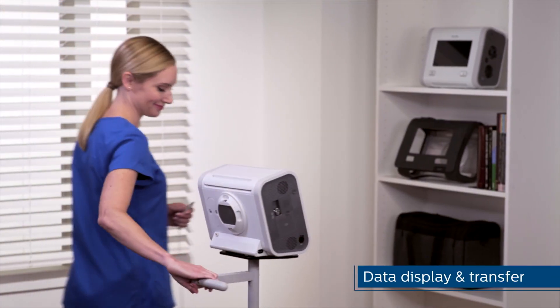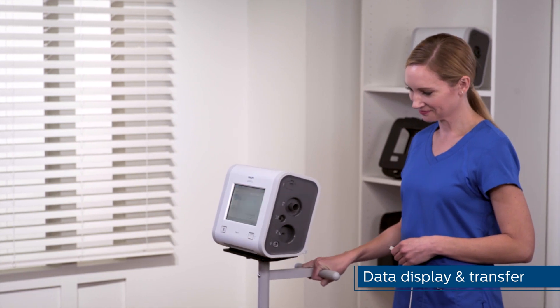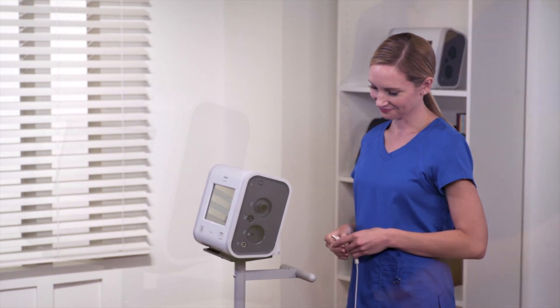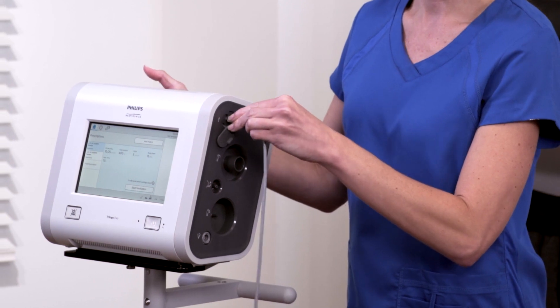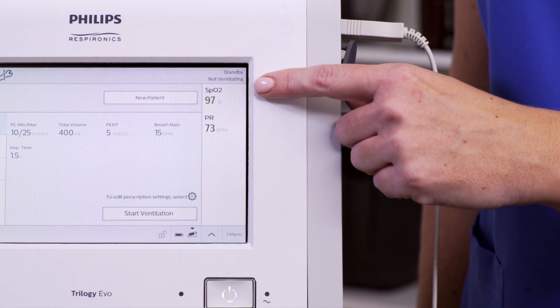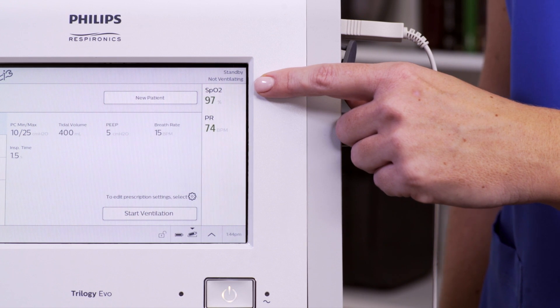Trilogy EVO offers several connection options for displaying and transferring data. First, we'll review the data display accessories: SpO2 and EtCO2. Insert the appropriate cable into the USB on either the patient or utility panels. You can see the SpO2 measurement in the monitor parameters pane and the pulse rate information in standby and various monitoring views.